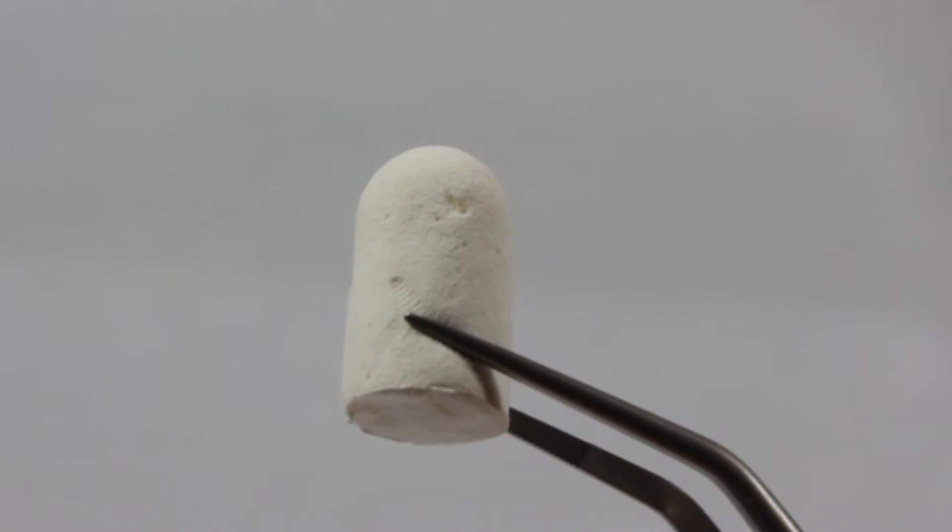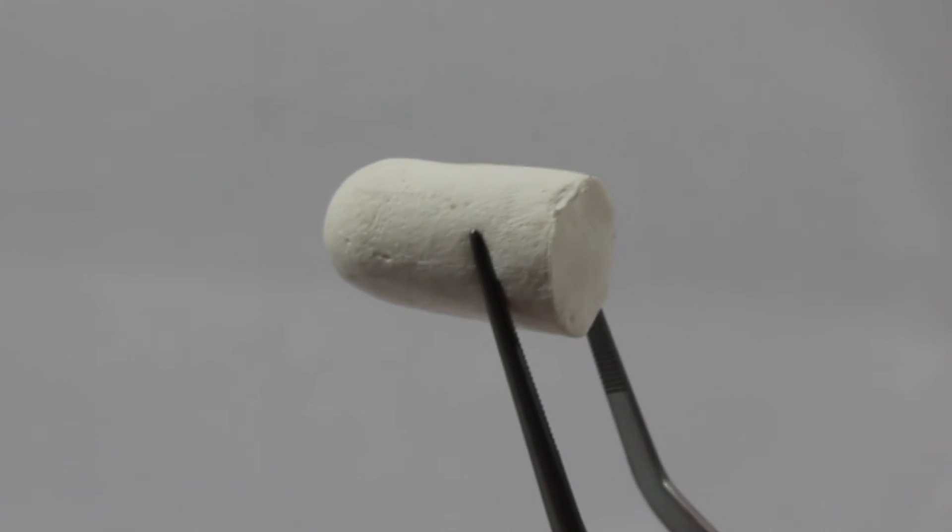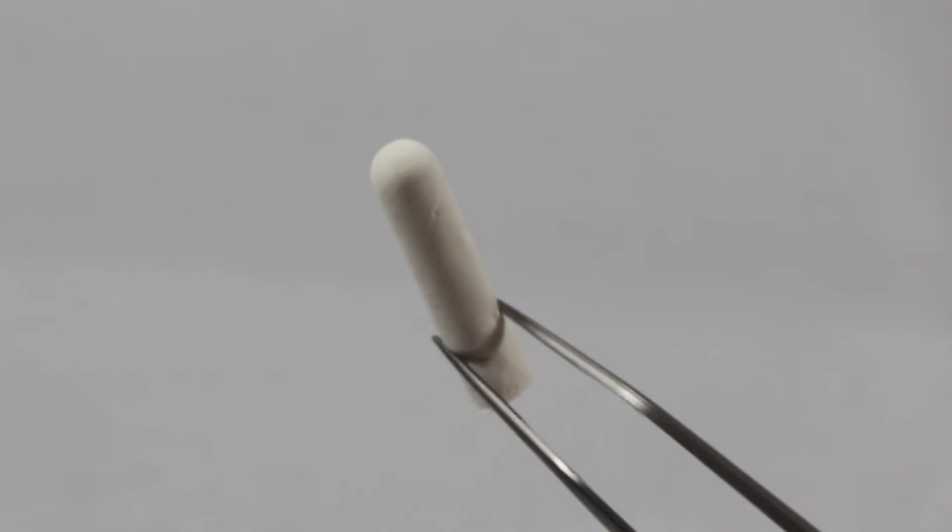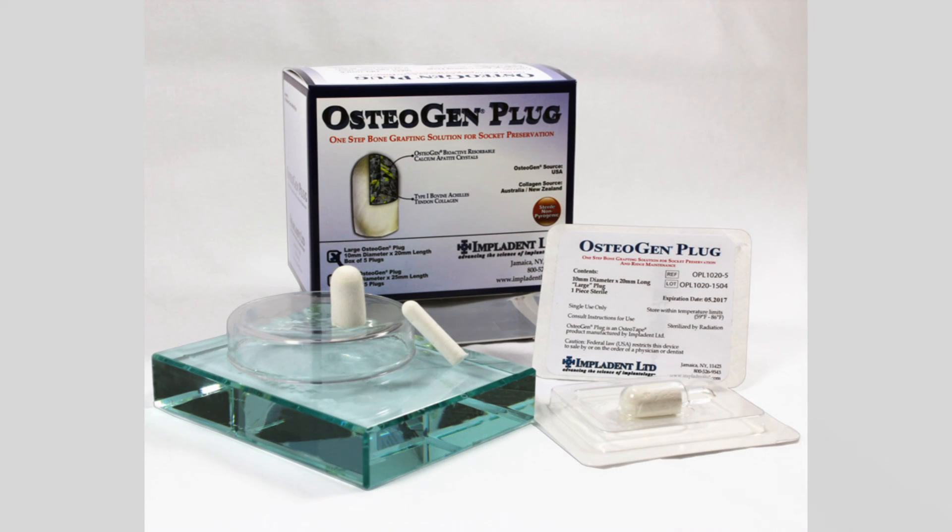There are a number of techniques used to graft extraction sites that all involve filling a site with particulate graft material and covering the graft with a collagen plug or other type of membrane. By combining the graft with a collagen carrier, the Osteogen plug saves the end user both time and money.